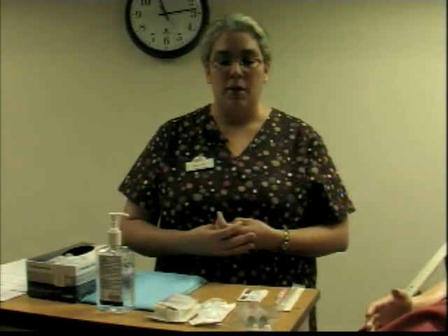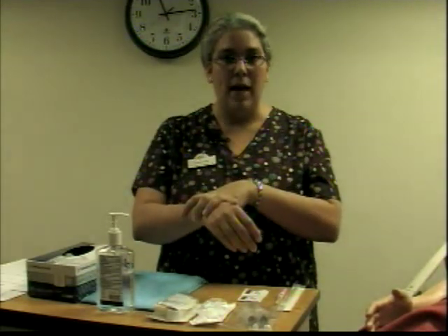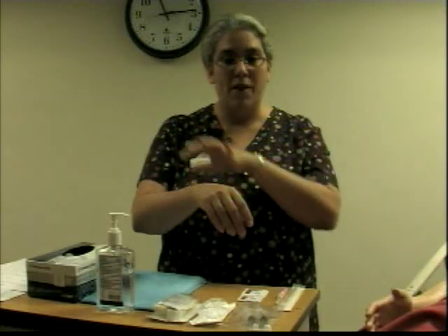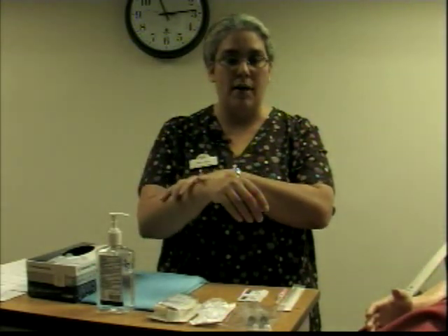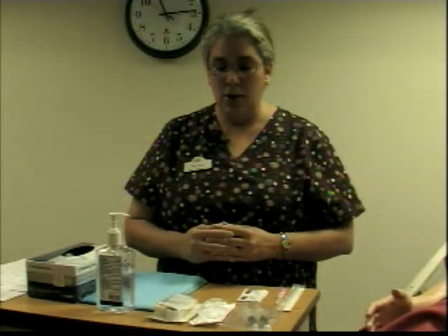The other option is for a client that has severe diabetes and is on hemodialysis. They will place on the client what they call an arteriovenous shunt, which is a connection between an artery and a vein to allow the technician to perform hemodialysis on the client. Therefore, it's a big contraindication to start an IV on that extremity.